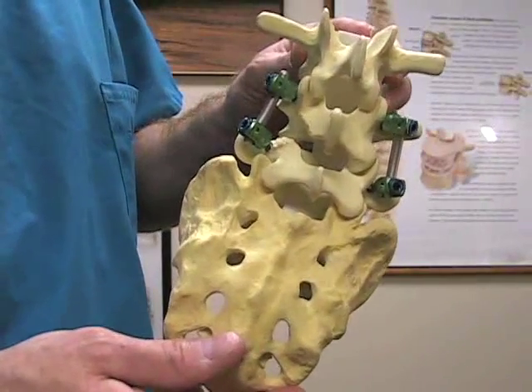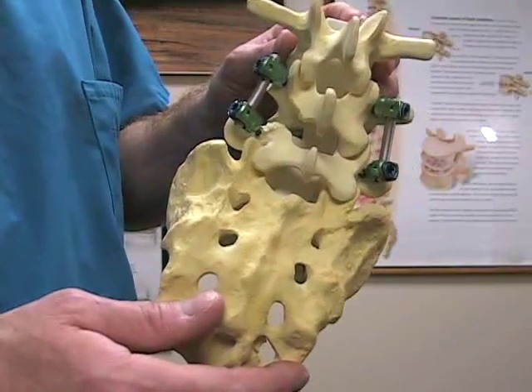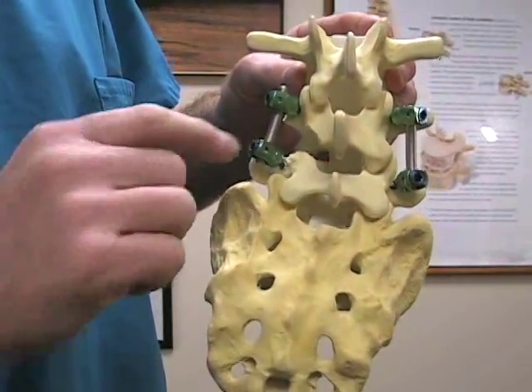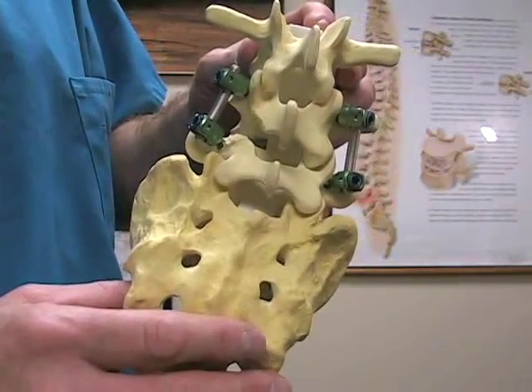We usually will do some drilling of your own bone away as well in order to gain access into the disc space, and that bone that we drill away will also go into the disc space and into the implant device, so some of it is actually your own bone. This is a type of procedure that we're more commonly doing these days, which still involves a lumbar interbody fusion, but also augments it with what are called pedicle screws, and these are the pedicle screws on either side. Now, one advantage to this procedure, which we call a TLIF, which means transforaminal lumbar interbody fusion.